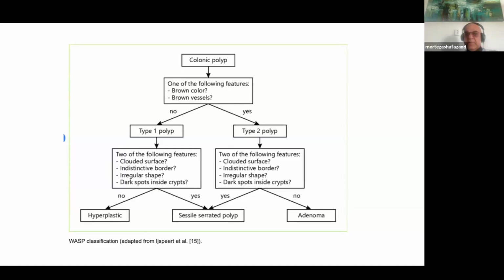I don't know if there is any data behind that, but my impression is that when AI misses some lesion, it's mostly a sessile serrated lesion rather than an adenoma. You have the AI on and you find the sessile serrated lesion, but it doesn't react at all until you get close to it or you put acetic acid on it, then it wakes up.